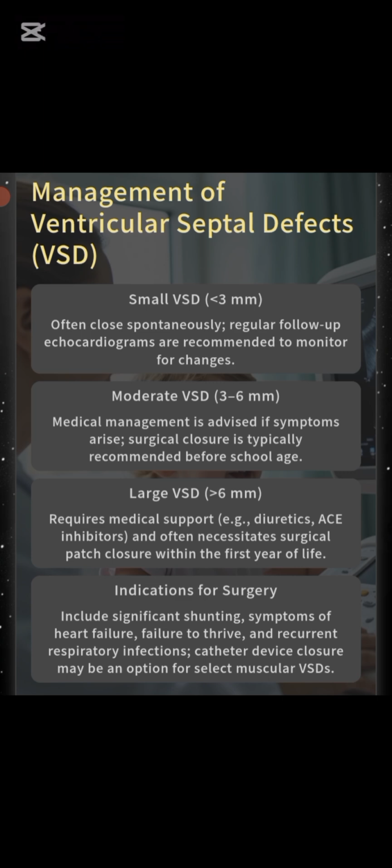The VSD size matters because it is a congenital defect and may be diagnosed accidentally at an elderly adult age. Therefore, its parameter from small to large also matters. So, a basic measurement method at all ages is to compare the size of the VSD with the aortic annulus diameter.